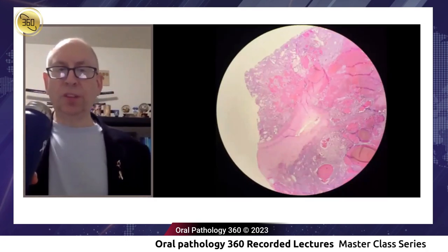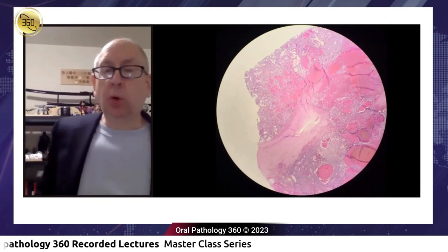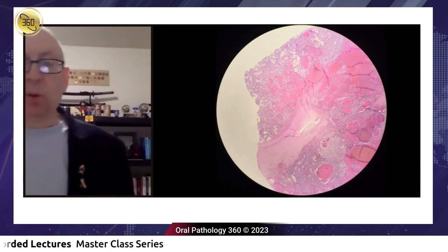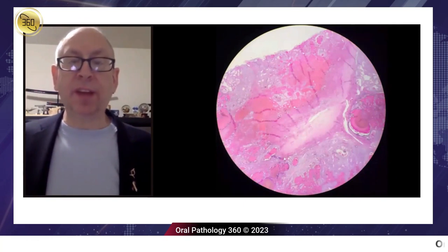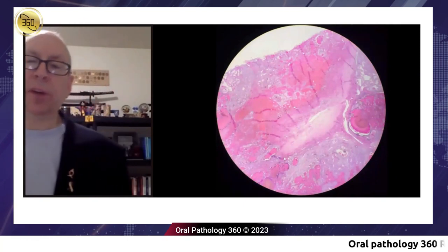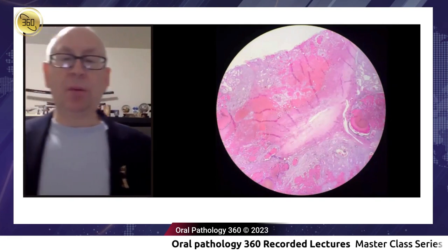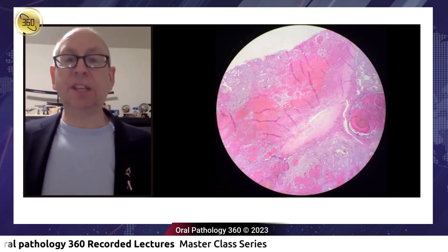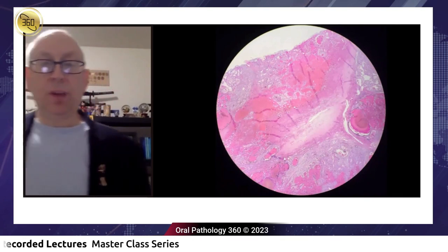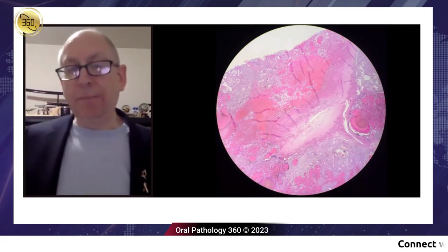So I'm going to start with this bloody kind of mess. And whenever I'm outside the oral cavity, I'm going to go look for something normal. I don't see anything normal here yet. All I see is a very hemorrhagic tumor. Well, I can think, okay, what are the organs behind the retroperitoneum that are hemorrhagic? The only really retroperitoneal organs you have are the kidneys and the adrenal glands. So guess what? I'm going to show you a kidney or an adrenal gland tumor probably, right?